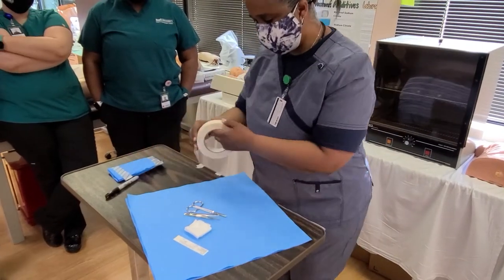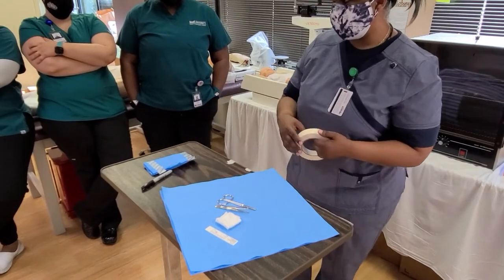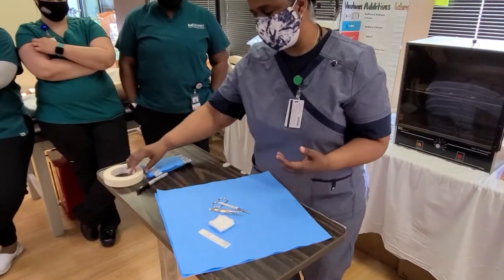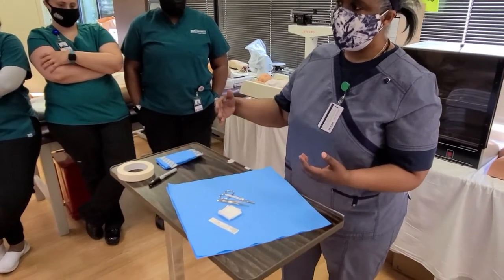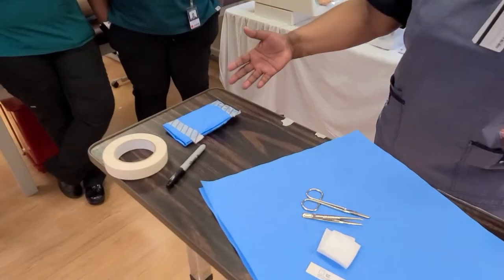This is autoclave tape. You may not be able to see it, but it has lines on there. When it's exposed to heat, it becomes black. But that doesn't tell me necessarily that my instruments inside are actually sterilized — it only says that heat got to it.